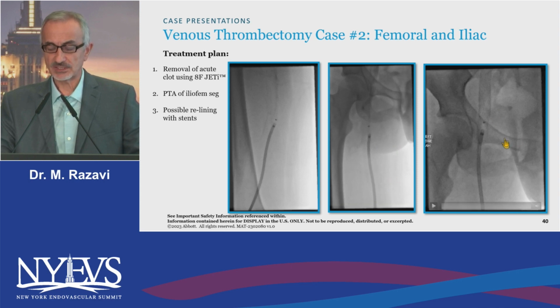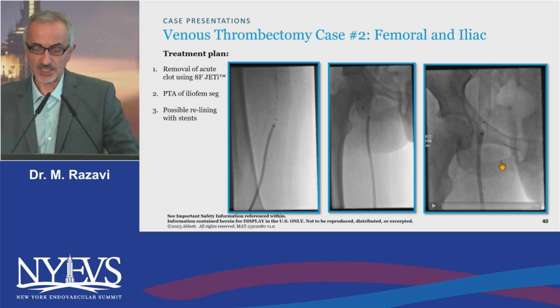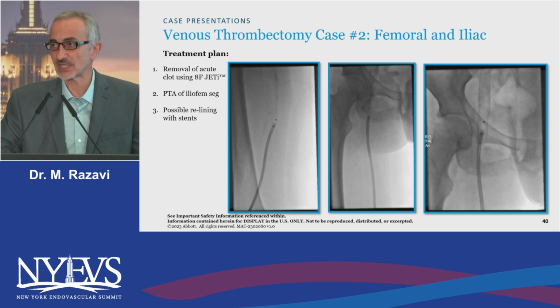Now, what I want to show you here is, at this point, we don't have an outflow yet. We have not opened up, and our inflow is limited. When we turn it on, look what happens to the stent. You see that? This is how we know we evacuated the entire content of that segment. And that's why in a synthetic bypass, when you put this into a fem-pop bypass and turn it on from the proximal segment, it's going to evacuate the entire thing. It's a very powerful system.